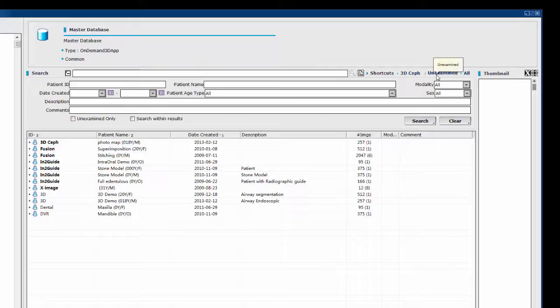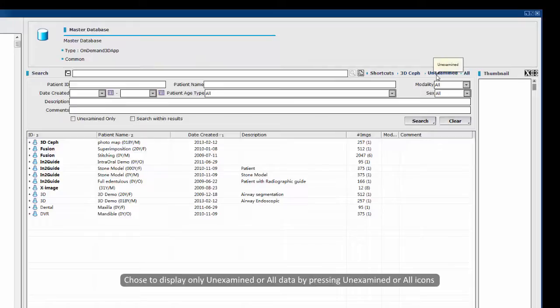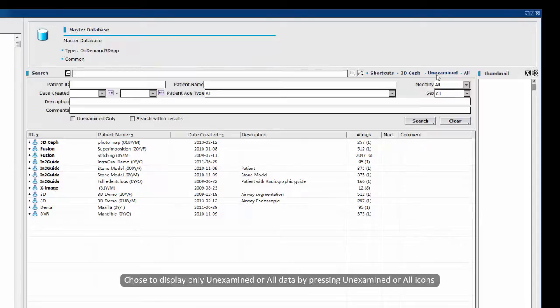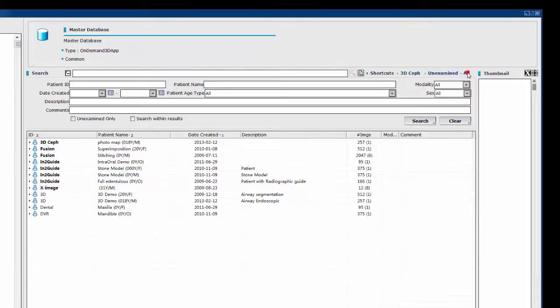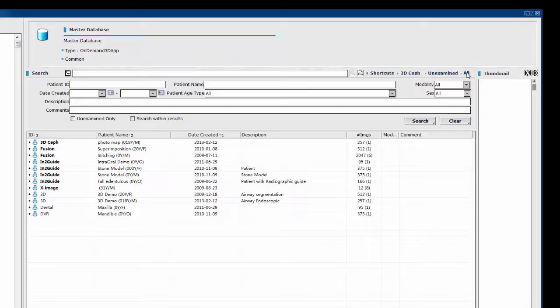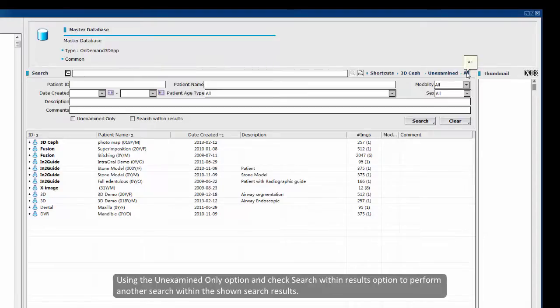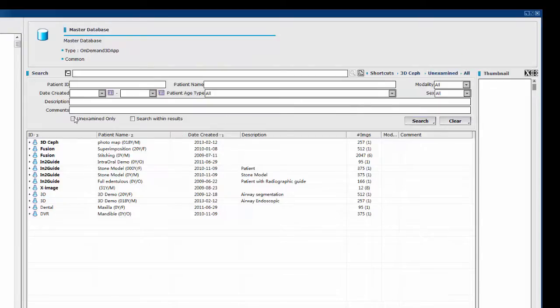Lastly, you can also choose to display only unexamined or all data by pressing the unexamined or all icons on the search bar. The same can be applied to search results using the unexamined only option and check search within result option to perform another search within the shown search results.